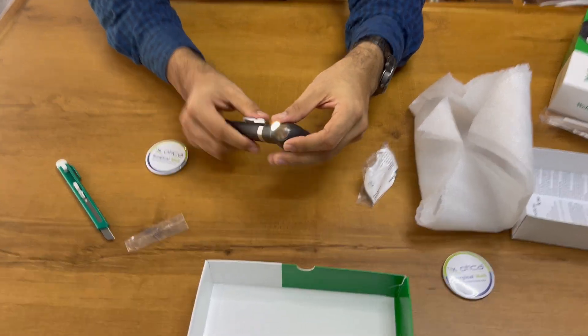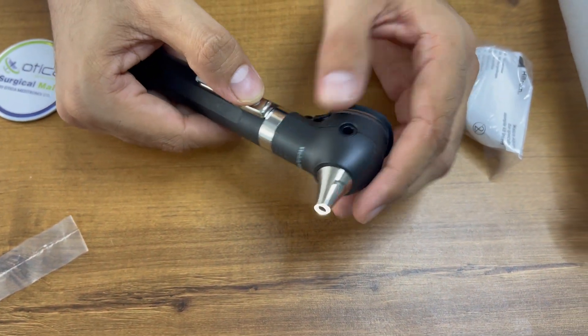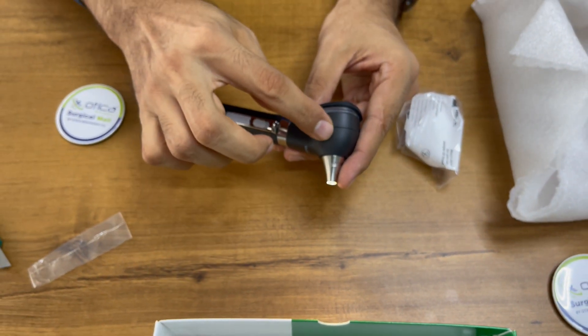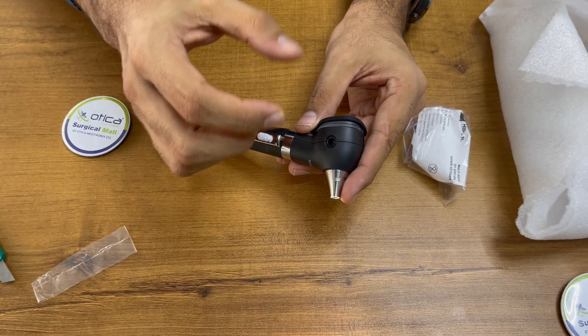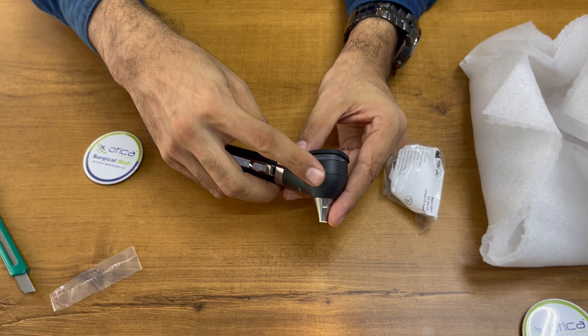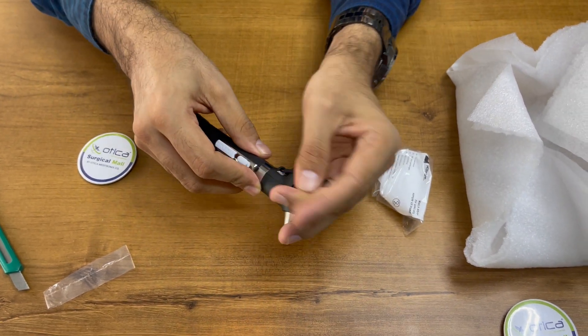You can see this is the fiber optic LED. This is the on/off button — you can see on and off. The main additional benefit is this window, from which you can do pneumatoscopy: you can insert air or generate pressure inside. This is the bumper lens; you need to put it like this.